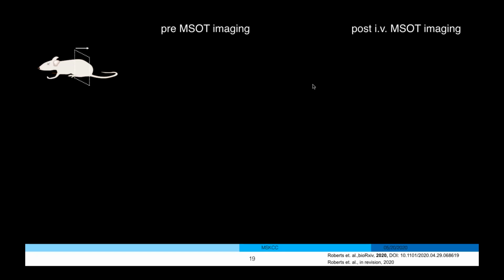And just before I start the video, I want to mention that we chose this model to focus on reproducibility, in order to reduce the complexity that comes with imaging the pancreas, as I mentioned in the beginning. We want to minimize the physiological challenges that already exist when imaging the mouse pancreas, because the structure of the pancreas in mice is quite different from humans: it is rather flat and dendritic-like, whereas in humans it's a solid mass. Still, in our studies we have also demonstrated uptake in the pancreas.